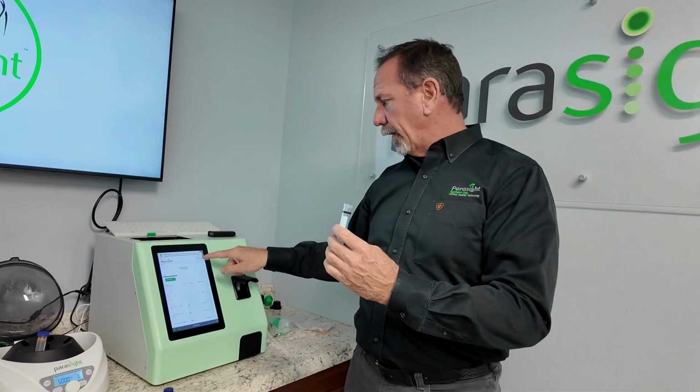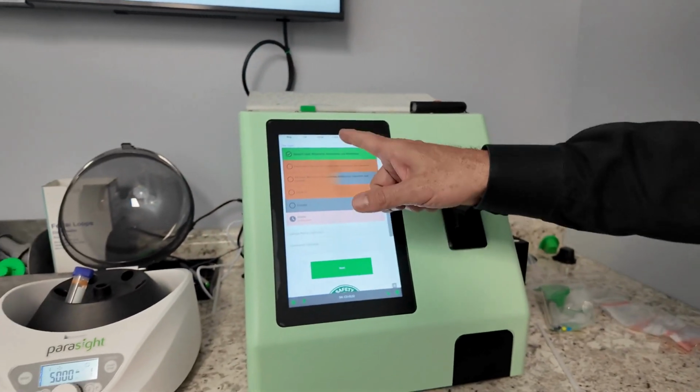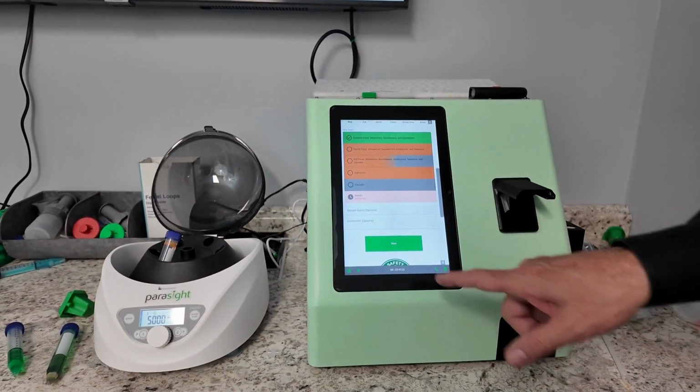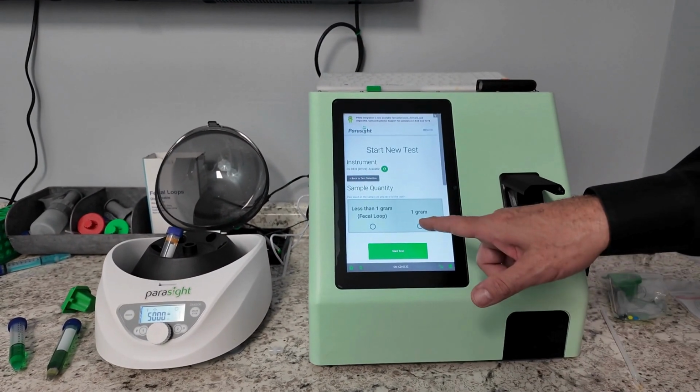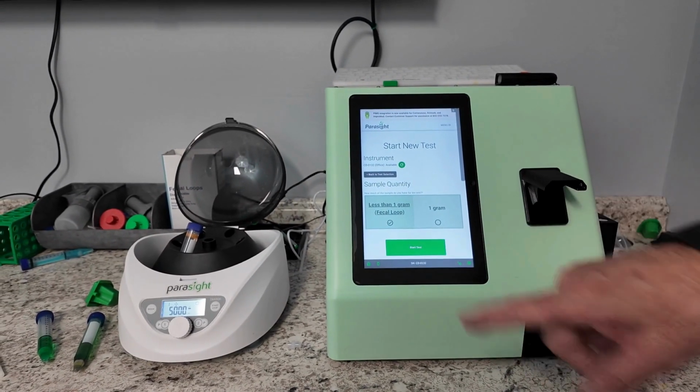So I'll go ahead and have that open. Go ahead and hit next. We picked out our patient. We picked out the test we're going to run. We're going to go ahead and start the test. So we hit next. In this case, we used a fecal loop. So we'll pick the fecal loop and we'll hit start test.